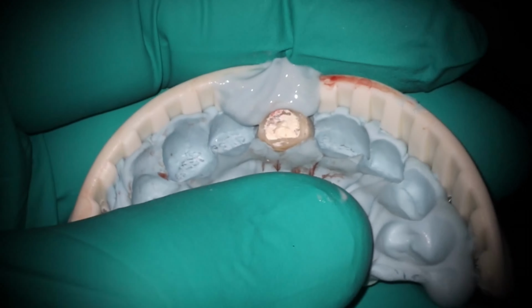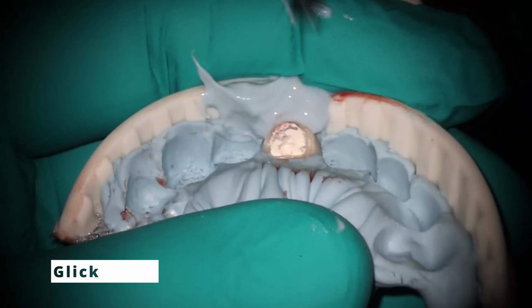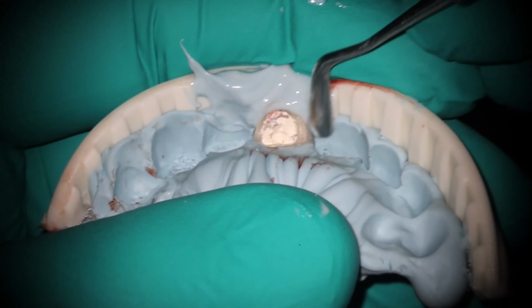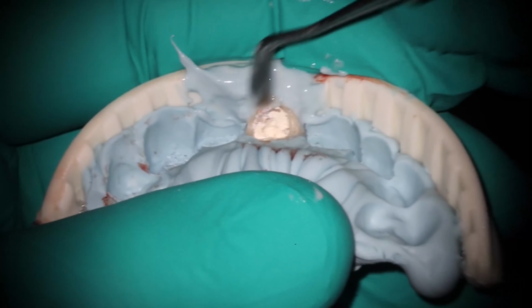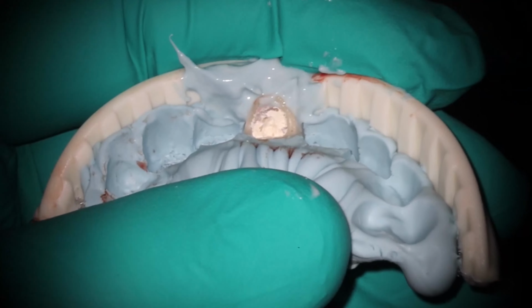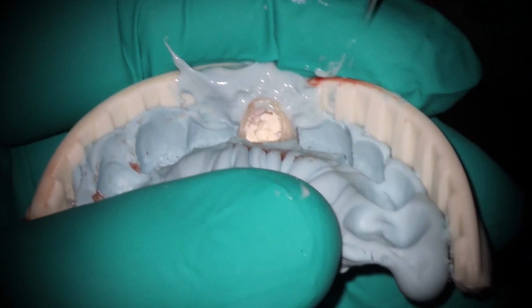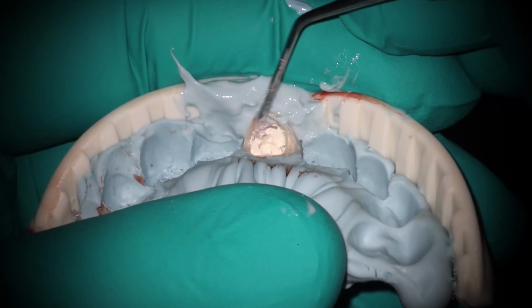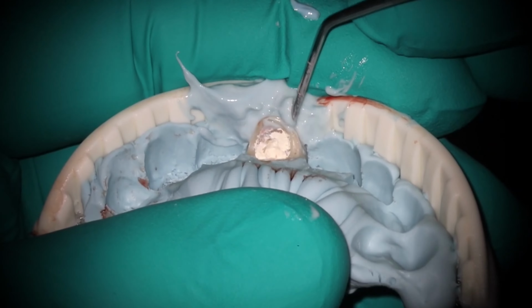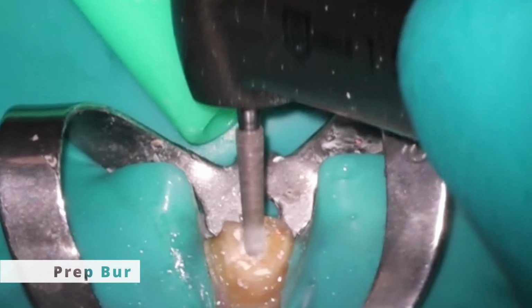I added just a little bit of blue bite here along the buccal to make sure we capture that gingival margin. I ended up liking my final x-ray and my final shape better than the actual pre-op. I'll show you in a few moments at the end of the video what those two different ones look like. But this just allows you to capture the anatomy. You can see how much of the existing build-up material was inside the crown itself. So let's go ahead and start this off.